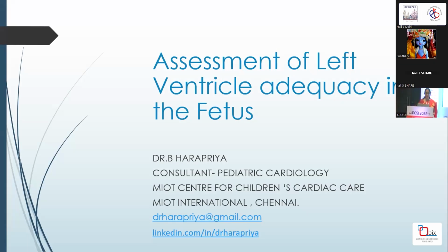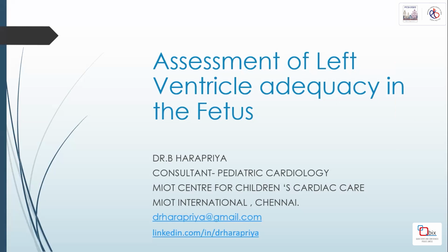So after having gone through a lot of basics, we are into the most common clinical problem which we encounter: assessment of LV adequacy in the fetus.